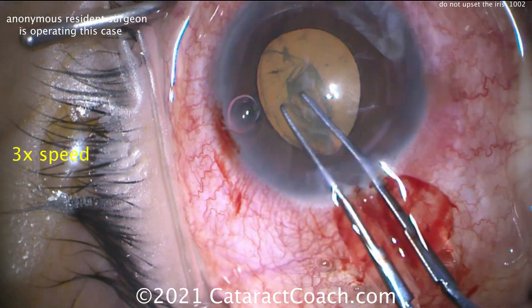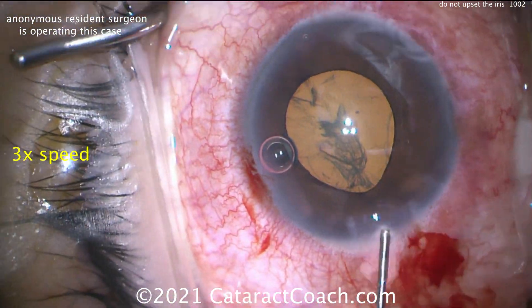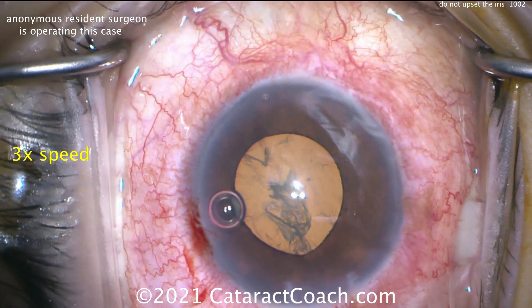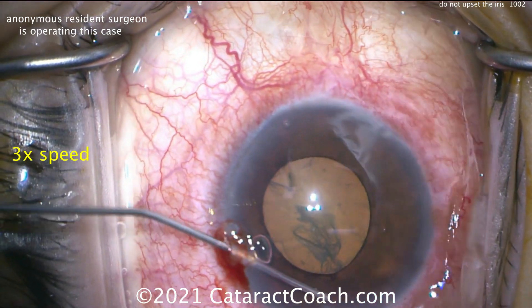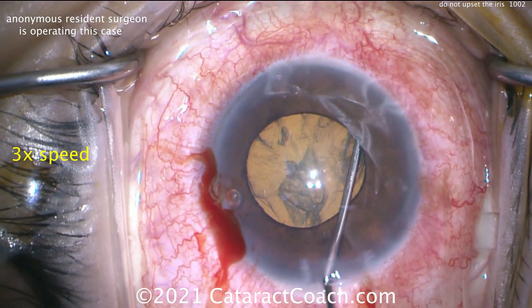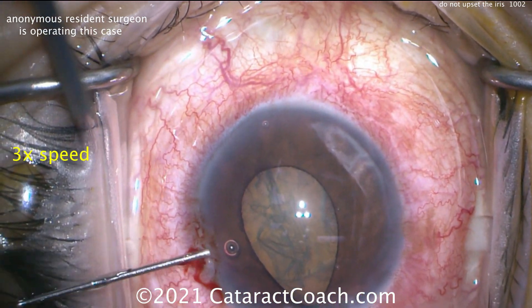That rhexis looks pretty good, continuing. Trying the little maneuver to bring it back and hopefully complete that rhexis. Okay, hydrodissection now. The pupil's already a little bit peaked, so be very careful here. The microscope is moving a bit — it's a resident surgery, so we roll with it. All right, there's the eye — let's get this hydrodissection done, nice and gentle. There's the hydrodissection. It looks okay.